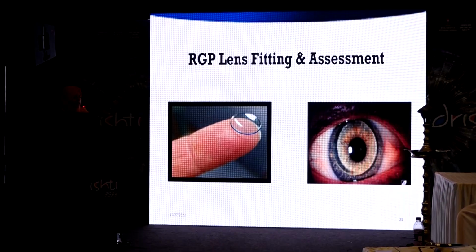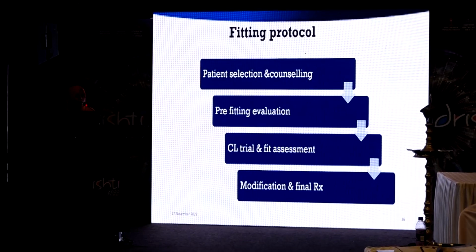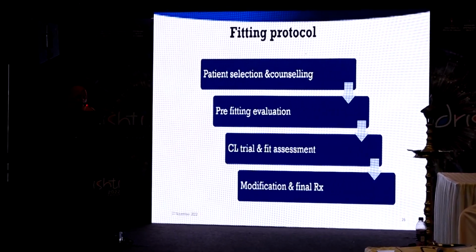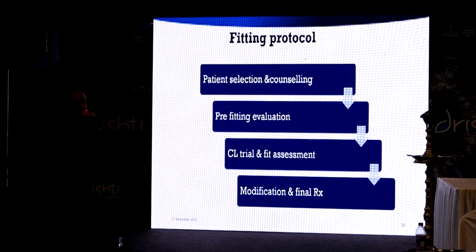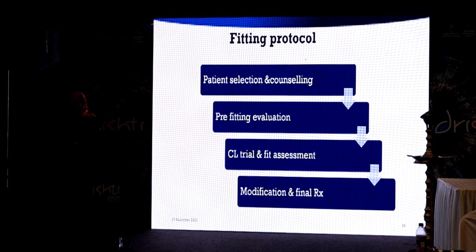are there. Next, I move on to the RGP fitting and assessment. The same fitting protocol as the soft contact lenses, but extra we have a counseling because a hard lens will take time for the patient to adapt. So we have to counsel the patient before we fit RGP lenses.